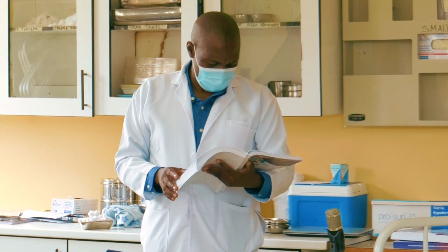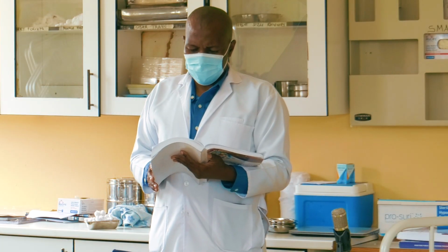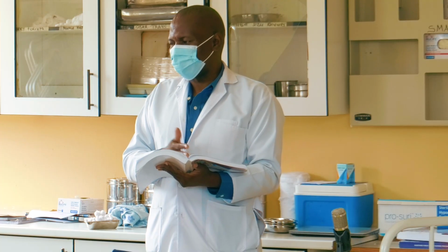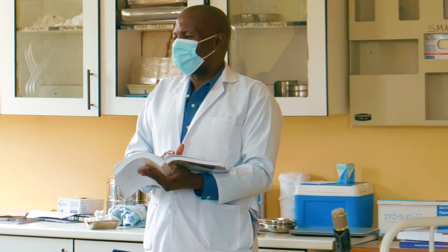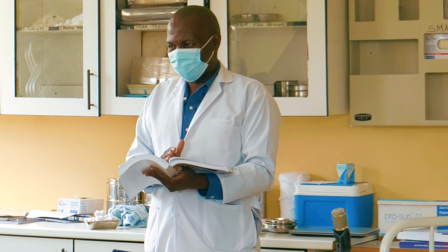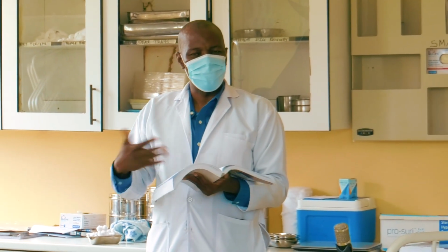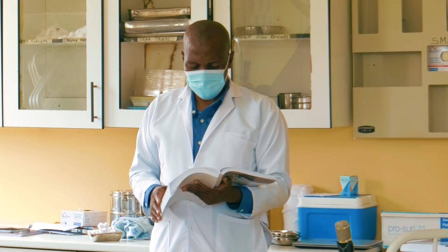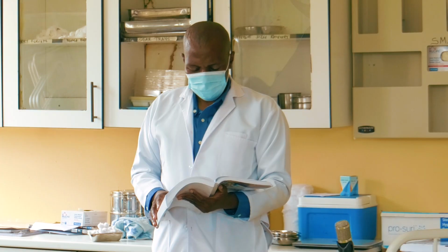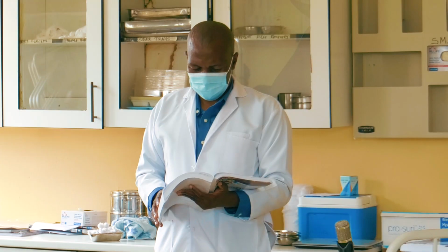So the indication is clean open surgical wounds, deep and skin layer. It's just the skin layers that we are doing because we are calling this one simple suturing. We are not touching any other organ. It's just the skin, and this should be clean. Why? We don't suture a wound that is dirty or contaminated because we are closing in microorganisms that will later on form pus and the wound is going to be bad. If we suspect there may be microorganisms or it's dirty, we don't close it.